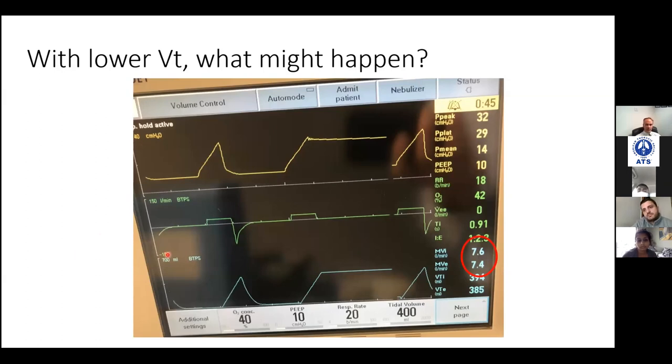Is that going to cause a problem? Sometimes high respiratory rates can cause a problem, especially if we start stacking breaths, right? Is that likely to happen in him? No. I think you're right. Why do you say no? I mean, we're afraid in patients with asthma from auto PEEP, but he's got the wrong diagnosis, right? That's exactly, you know, listen, I'm with you. I agree. But even looking at the ventilator, we can tell, right? Look at this. His exhalation is getting back to zero really quick.